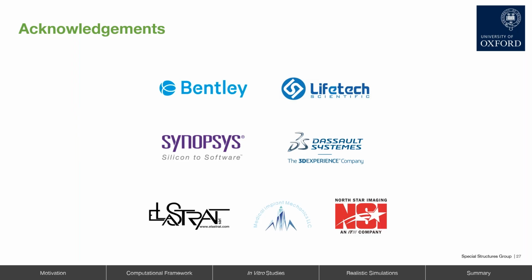Yeah, so great question. We were very fortunate to work with Elastrat. And so we worked with them to use one of their off-the-shelf models. What I'd highly recommend if you're interested in really good high-quality models, ones which are readily available, is please get in touch with them. I think they provided us with a really great service. The particular model that we used was an off-the-shelf version. It's based on real anatomy, nothing too fancy. But if you're interested in custom models, I'm sure that they could help you out with that.